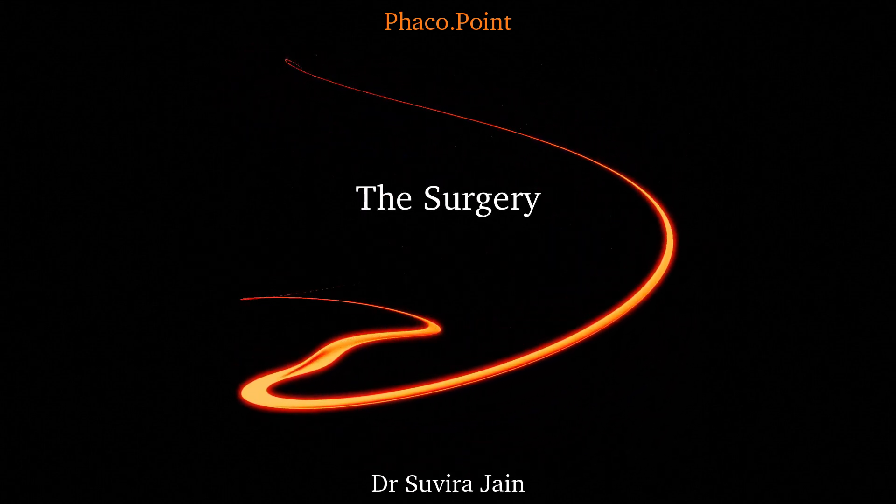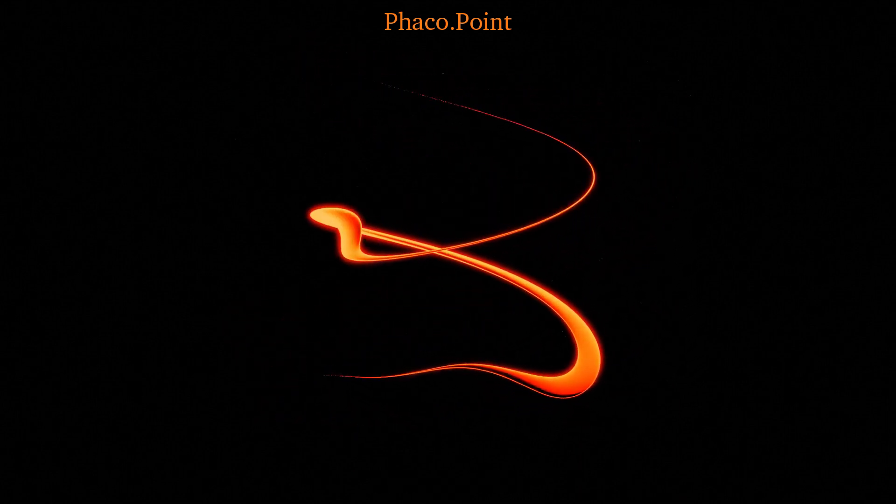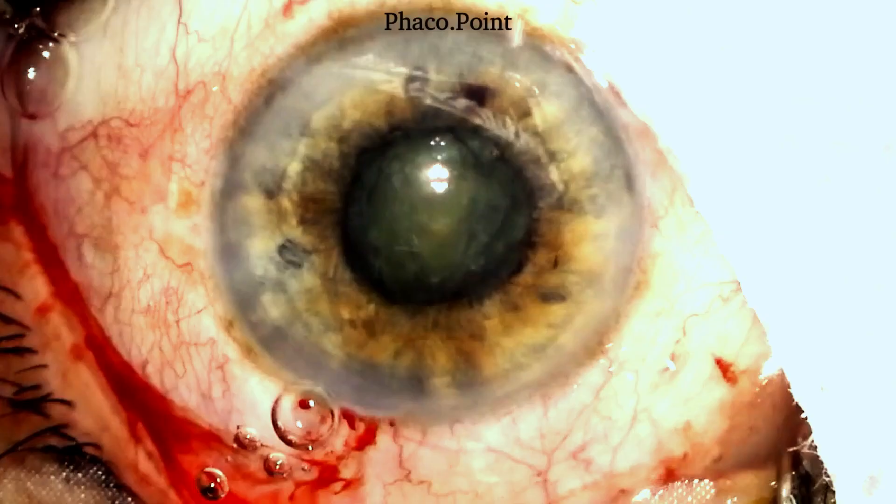Let's now move to watching the surgery. To start with, this was a patient with a non-dilating 4–5mm pupil. A stretched pupilloplasty was performed, which resulted in a slight dilatation of the pupil. However, following hydrodissection, the pupil came down to roughly 3–4mm as you can see.